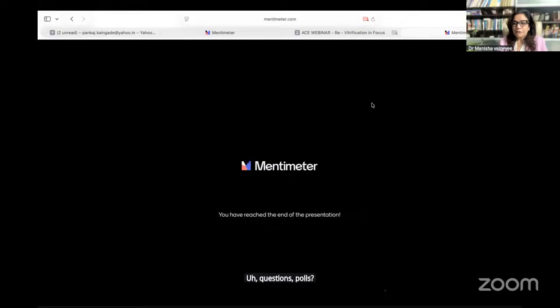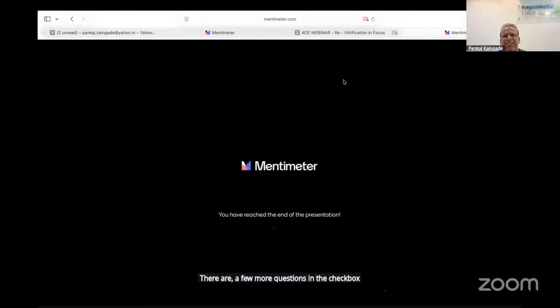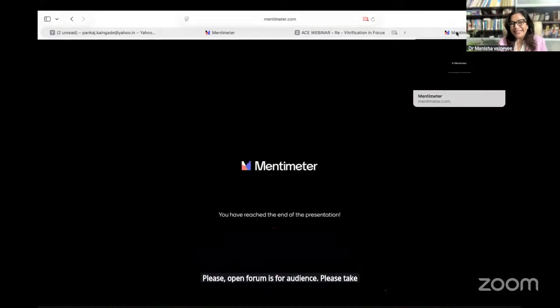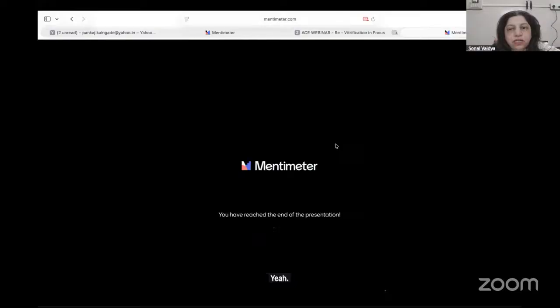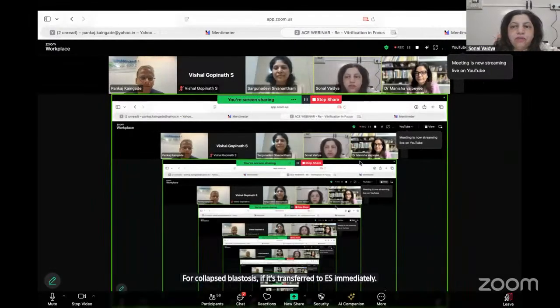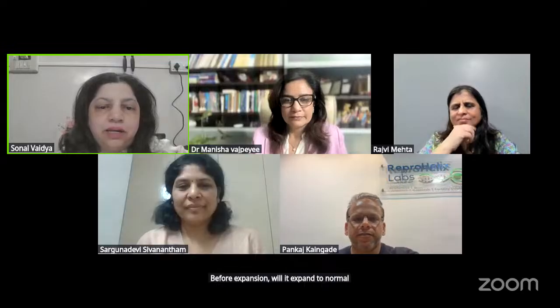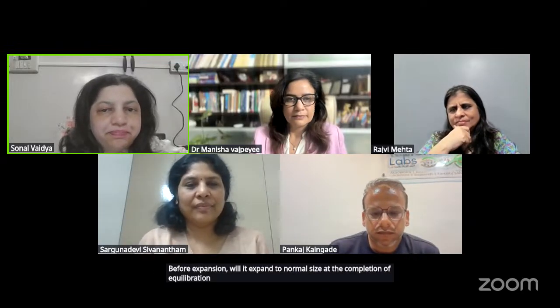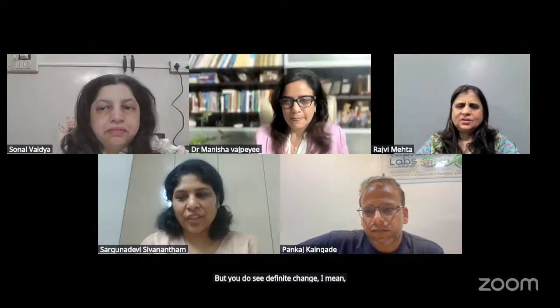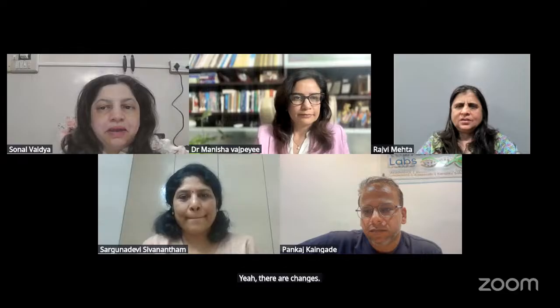There are a few more questions in the chat box. Yes, we can take them. Please, the open forum is for the audience. Please take all the questions quickly. So there's one question from Haswant Mohan Raj. For a collapsed blastocyst, if it's transferred to ES immediately before expansion, will it expand to normal size at the completion of the equilibration process? We don't see a complete re-expansion in general with the PGT embryos. But you do see a definite change. Yes, there are changes.